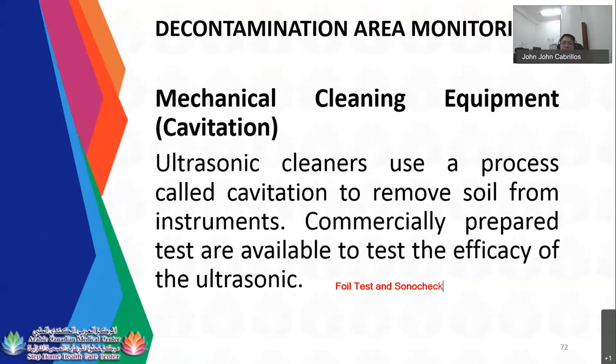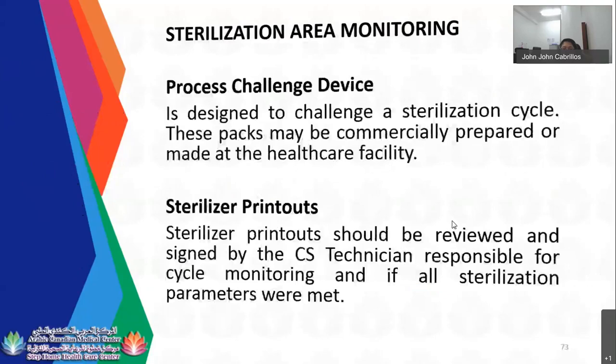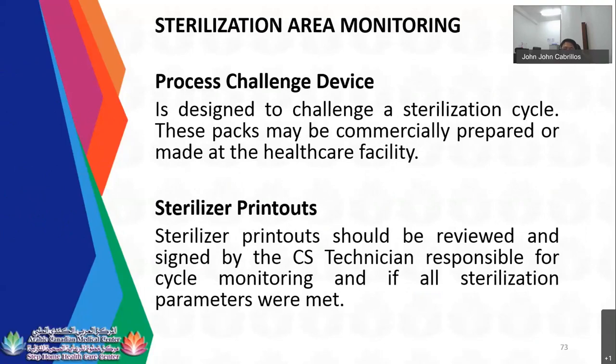For sonocheck, from green or blue initial color, it will change to yellow. So here's a vial or a glass vial or ampule, it depends on the manufacturer. You need to submerge it in the ultrasonic machine and then run it for 60 seconds, and it will change from initial color green or blue to yellow. So it is different from your biological indicator. A process challenge device is designed to challenge a sterilization cycle. These packs may be commercially prepared or made at the healthcare facility. So this is a sample of your Bowie-Dick device.